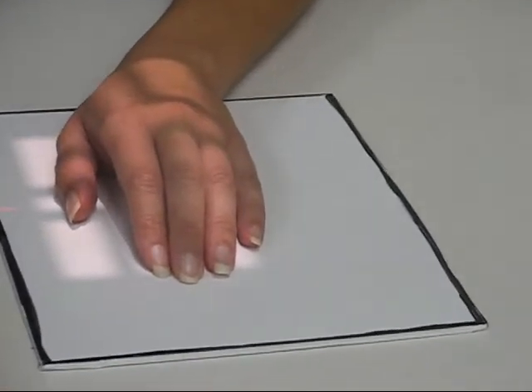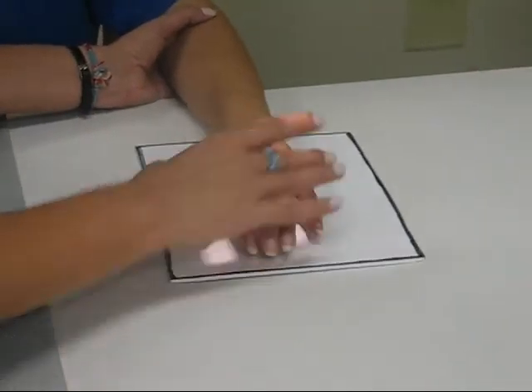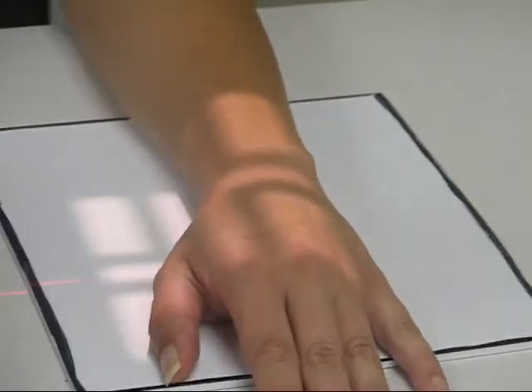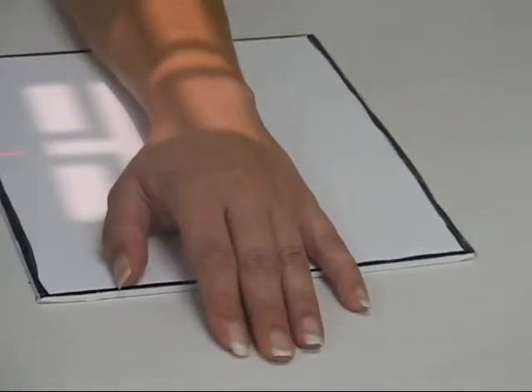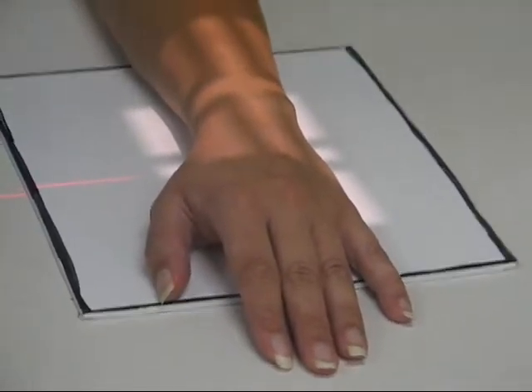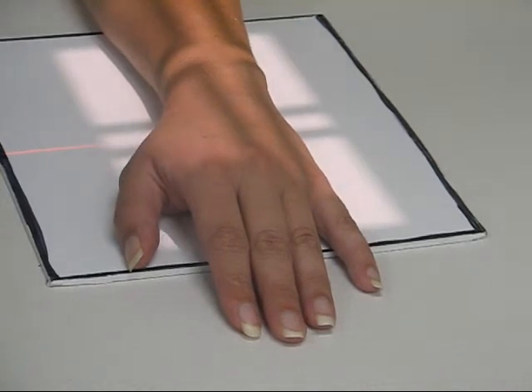So you're going to have to bring your patient towards me a little, very good, not too much, right there, to where the wrist and the hand are aligned. And you're going to put the central ray right in the middle of the wrist.